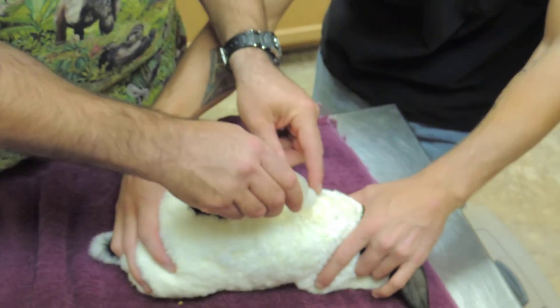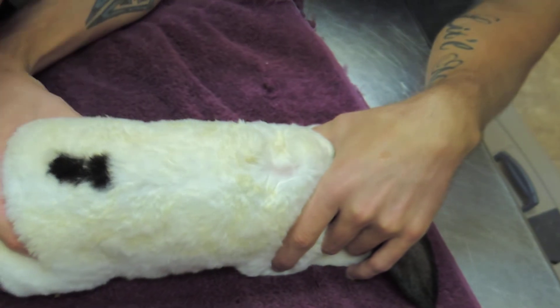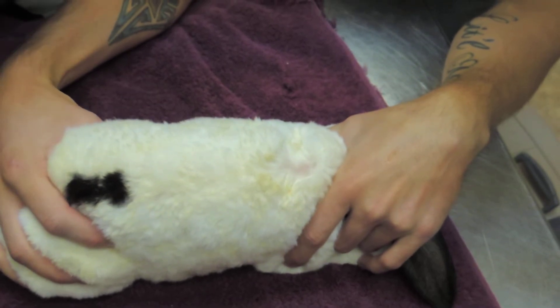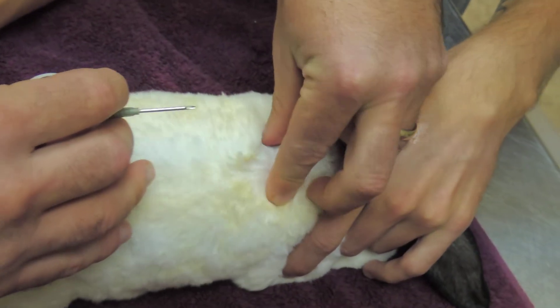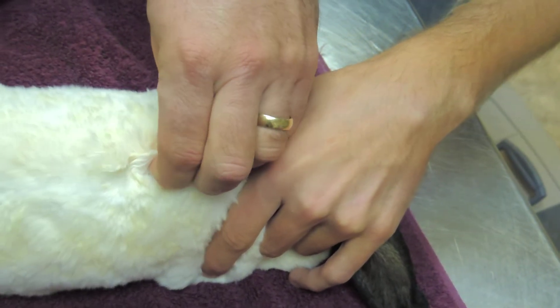What I do here for the little one is I just wet down the shoulder blade area, and I'm going to introduce the Microchip ID Solutions microchip, which is a small 15-gauge needle, into that area. What we'll do is lift up the skin, tent that up, pop it in the middle, and implant the chip — and it's done.